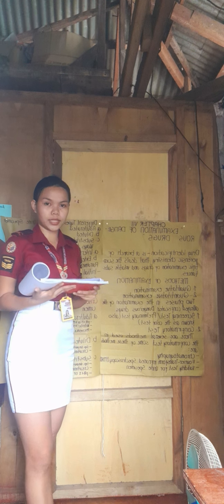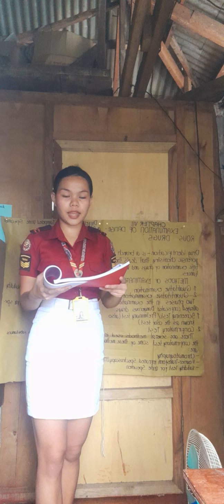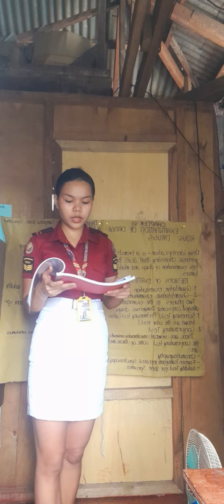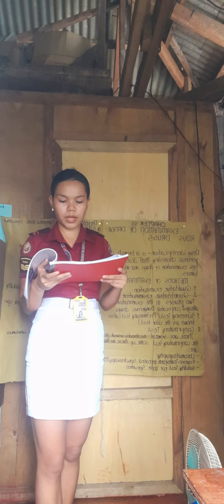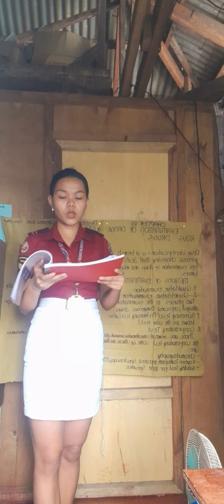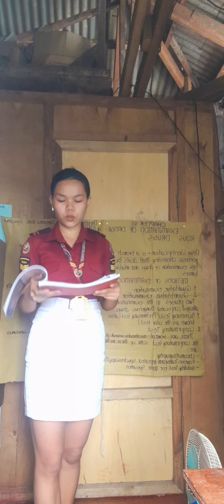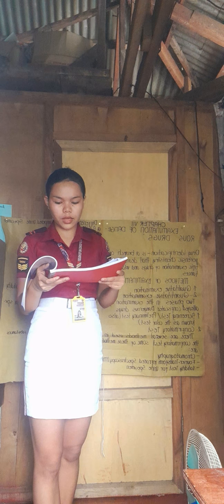Second is quantitative examination. When we say quantitative examination, it is a test that can estimate the amount of drug in a specimen. Currently, there are no instant drugs of abuse tests that give estimates of the amount of drug present in the specimen. The only way to get a quantitative result is with a laboratory test instrument. For example, you could test for the actual blood alcohol level.